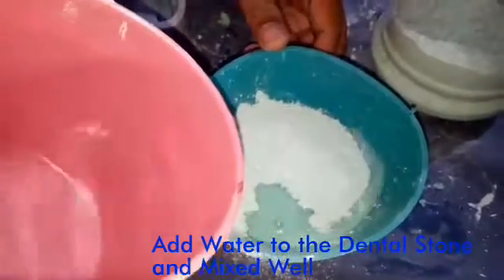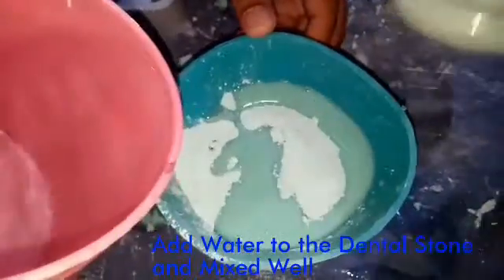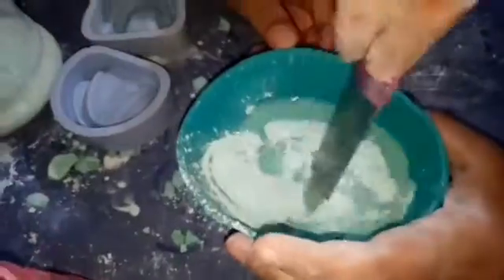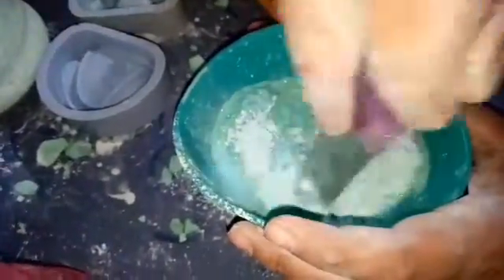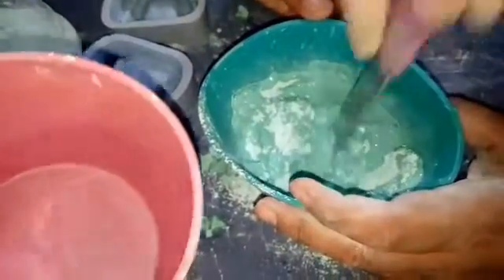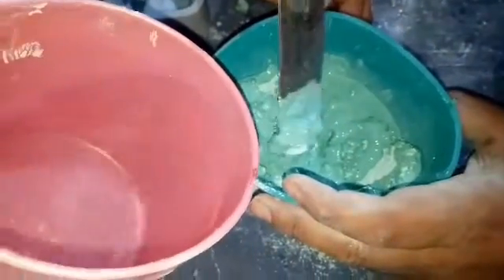Now slowly slowly add water into it so that it forms a paste — not so liquid, not so solid, but like a paste. As you can see, this is not yet a paste, so you can add a little more water.